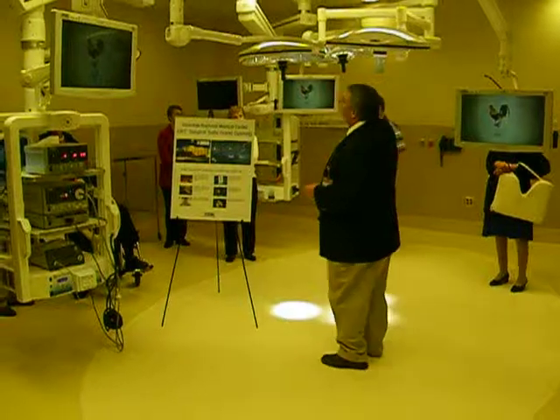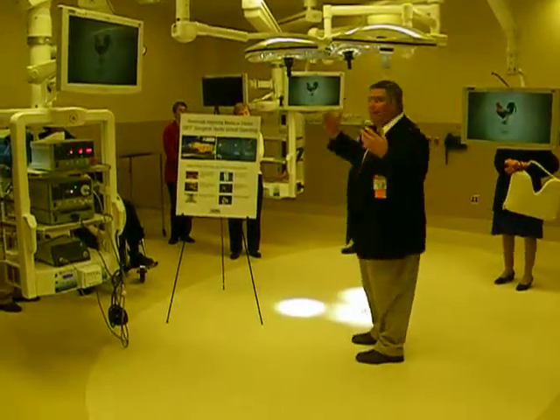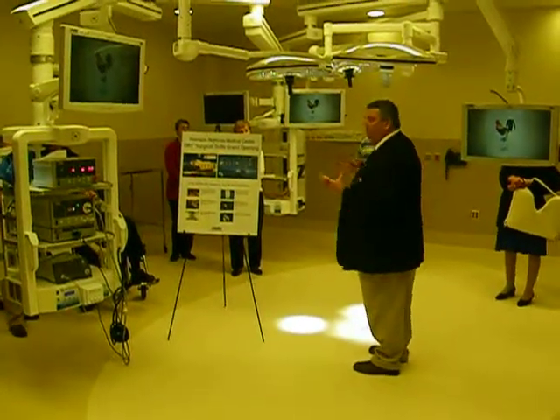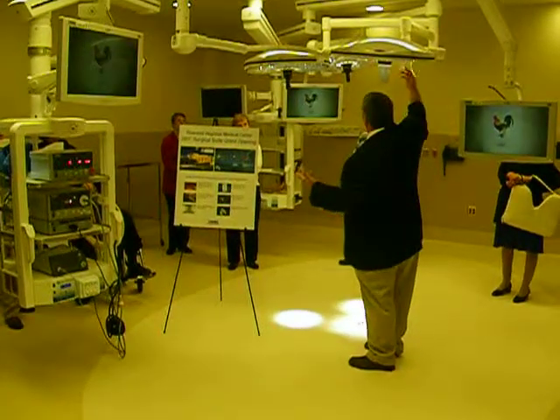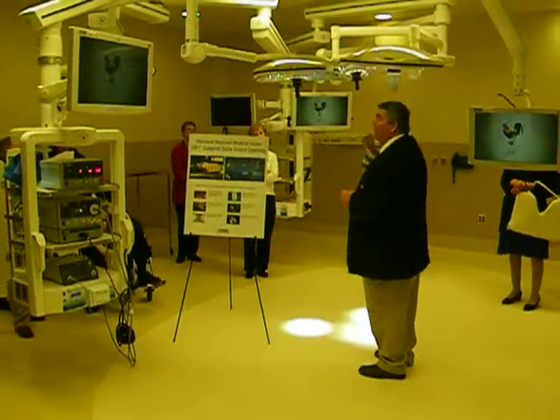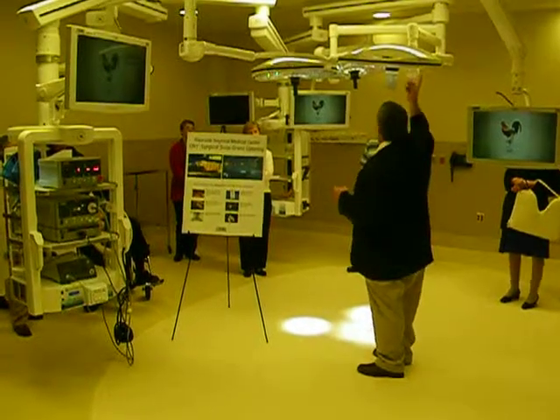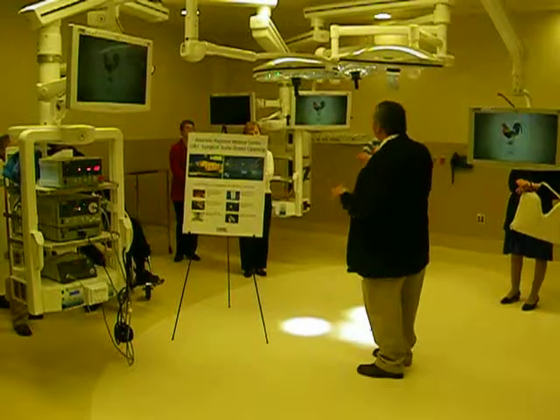We also have these great new surgical lights. The old surgical lights have halogen bulbs, very hot, so again, over hours, the doctor and the surgical team around the table are sweating, uncomfortable. This is LED technology, green technology, cool. Anyone want to guess how long these LED lights last? 10 years. And personally, when Skycom told us this, I think they made a mistake, because we don't have to buy any for 10 years, but hey.